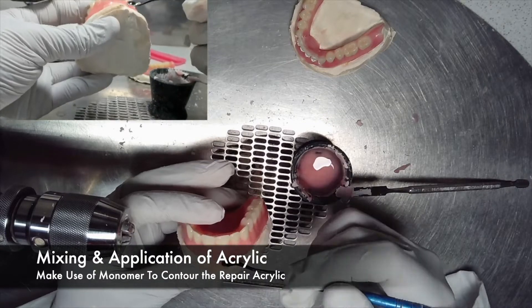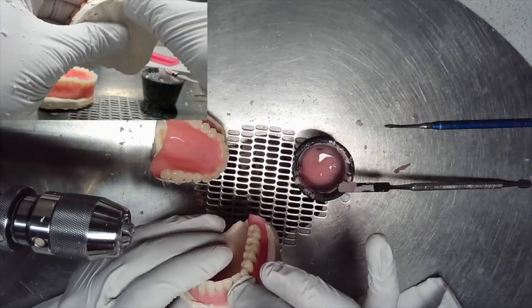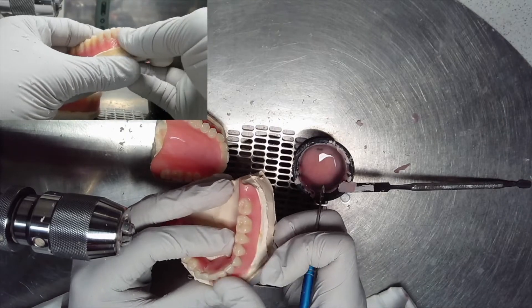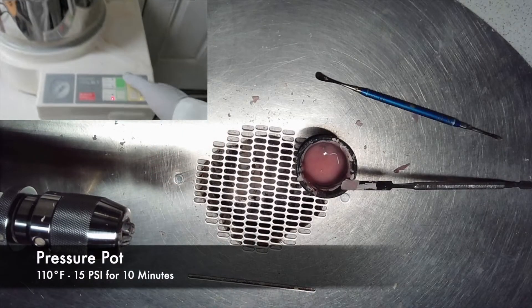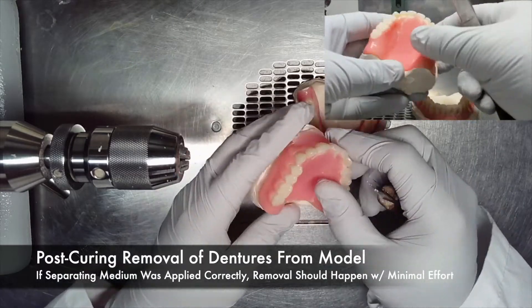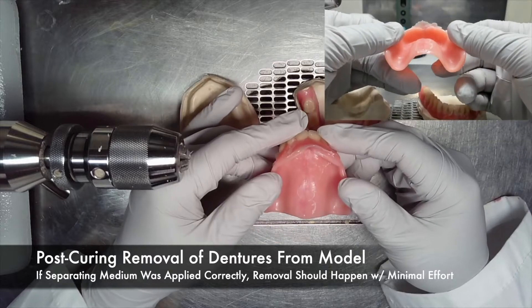You can make use of monomer and a tool to contour the repair acrylic in the repair areas. Once the acrylic work is completed, it must go into a pressure pot at 110 degrees Fahrenheit at 15 pounds per square inch of air pressure for 10 minutes. Once the curing is complete and the acrylic has completely polymerized, if the separating medium was applied correctly, removal of the denture from the model should happen with minimal effort.